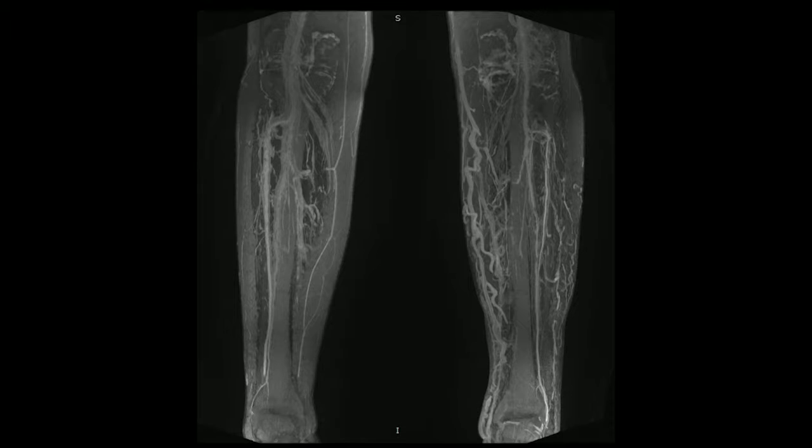There are arterial stenoses and occlusions. Some of the arteries are completely absent for very long segments, and this makes standard methods of segmentation like vessel tracking perform extremely poorly, and it also limits our ability not just to analyze these images, but to show them to our vascular surgeons and other interventional radiologists to show them where they need to get to if they're going to perform a revascularization procedure.